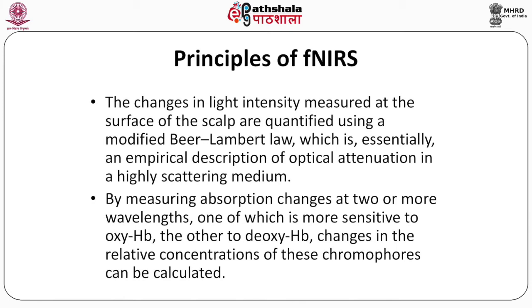By measuring absorption changes at two or more wavelengths, one of which is more sensitive to oxyhemoglobin and the other to deoxyhemoglobin, changes in the relative concentration of these chromophores can be calculated.